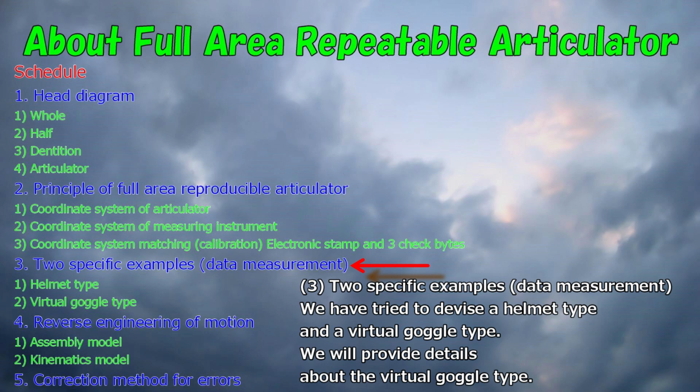3. Specific examples. Data measurement. We have tried to devise a helmet type and a virtual goggle type. We will provide details about the virtual goggle type.